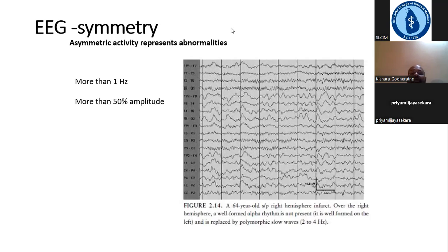Can you explain burst suppression? Right. Okay. So burst suppression is a burst of waveforms where the amplitude is high, and all of a sudden the EEG background is suppressed. I'll try to give you an example.